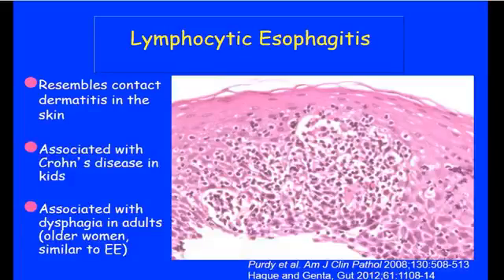All right, talk a little bit about lymphocytic esophagitis. I mentioned earlier that one does see lymphocytes increase, or can see them, reported in reflux, but recently we've been more and more interested in lymphocytic esophagitis in a couple of different clinical scenarios. For years, I've noticed that kids with Crohn's disease often have a lymphocytic esophagitis. And in fact, if someone's under the age of 18 and I see a lymphocytic esophagitis, I usually will bet the residents they have Crohn's disease, and I've not lost one bet yet.